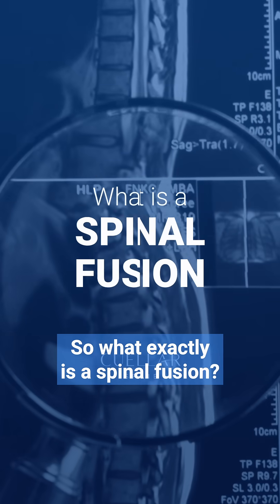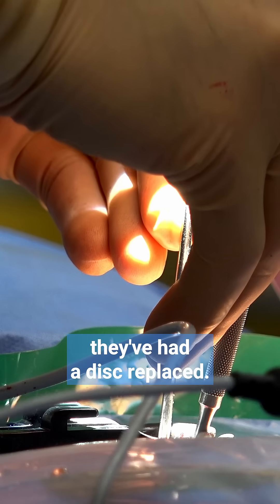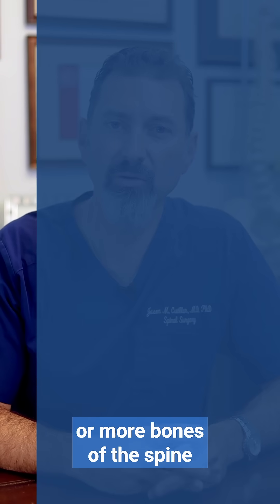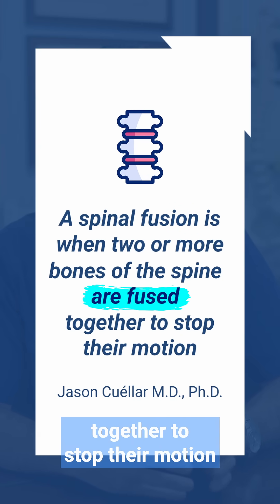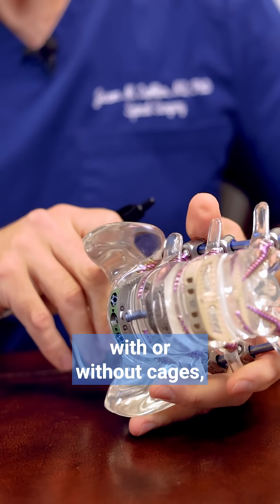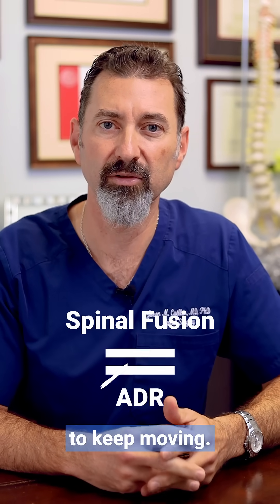So what exactly is a spinal fusion? Unfortunately, a lot of patients come to me after they've had surgery and they tell me they've had a disc replaced. Then I look at the imaging and I see they've actually had a fusion. A fusion is when two or more bones of the spine are actually fused together to stop their motion. This can be with screws and rods, with or without cages and various implants. But it's very different than an artificial disc replacement, which allows the spine to keep moving.